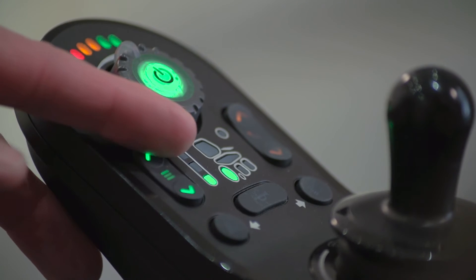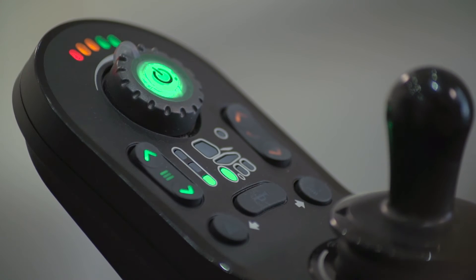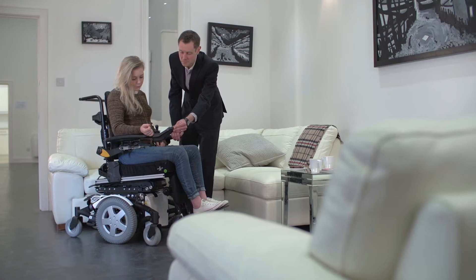The chair symbol features an illuminated drive wheel. Green and steady means drive at full speed. Green and slow flashing means the speed is limited due to a seat function or an inbuilt sensor.